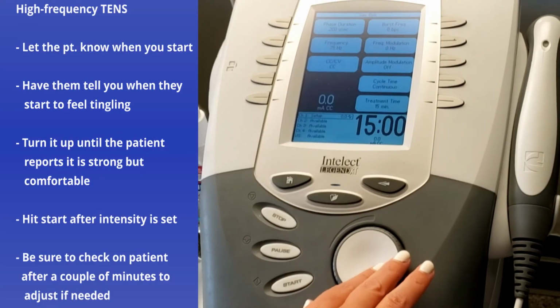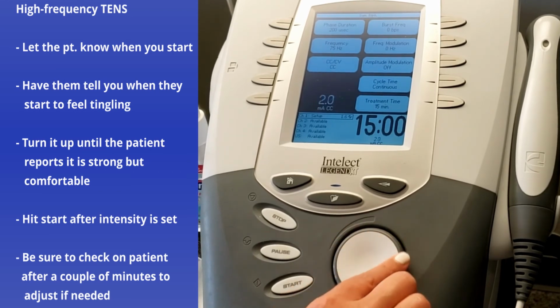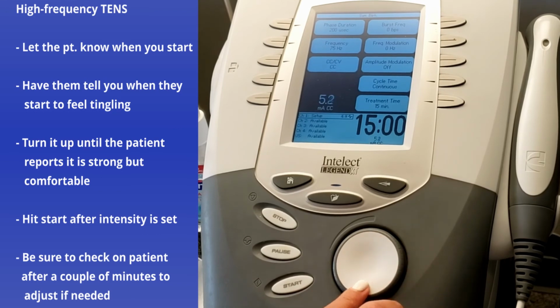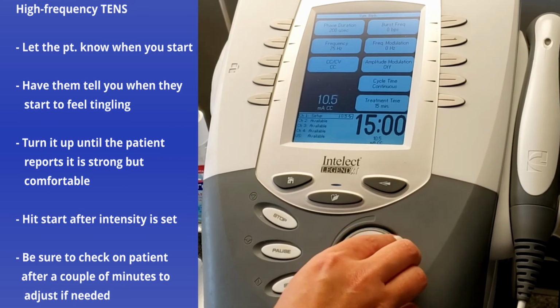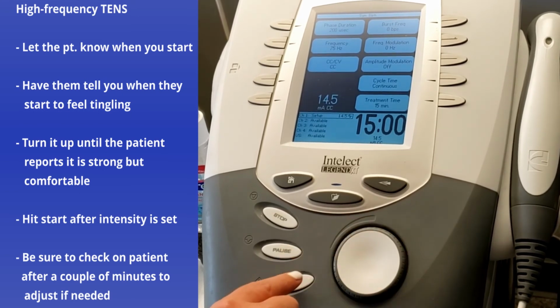I'm going to start turning up the intensity. Let me know when you start to feel it tingling. I'm starting to feel it. Okay, I'm going to turn it up until it's strong but still comfortable. So let me know. Right there. That feels good there. It's strong but comfortable? Yeah. Okay, we're going to press start and it's going to run for 15 minutes.